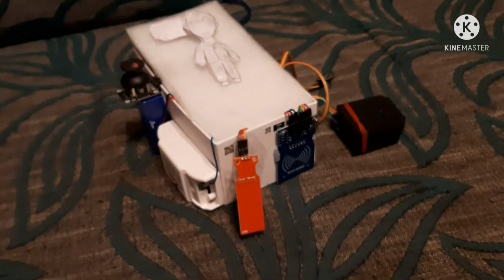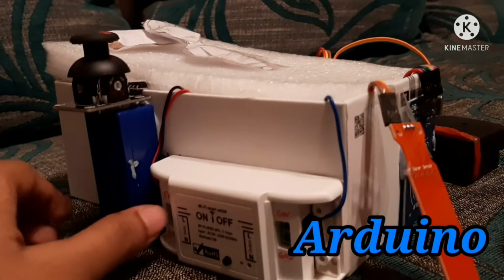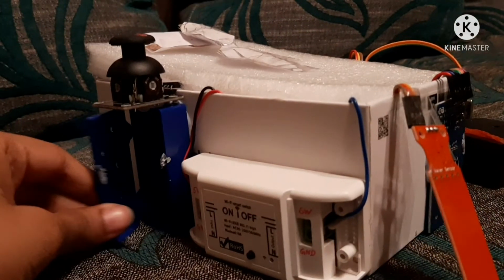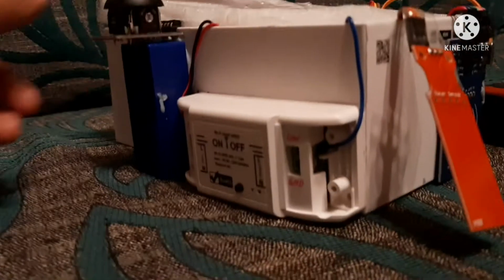This is a patient's bed which is controlled by an Arduino. The blue box is not just a support for the joystick which adjusts the bed frame, but it is also a storage unit for patient's essentials. There is a servo motor inside the bed which helps to move the bed frame.